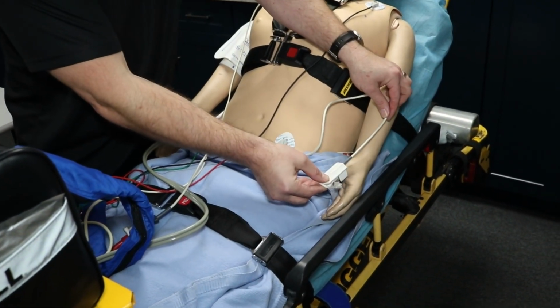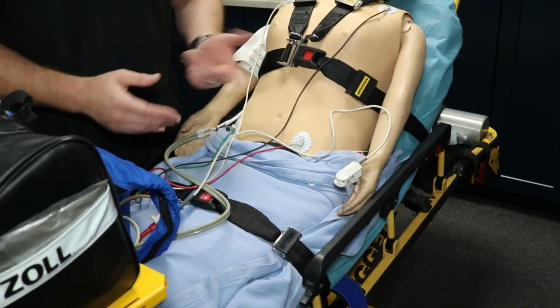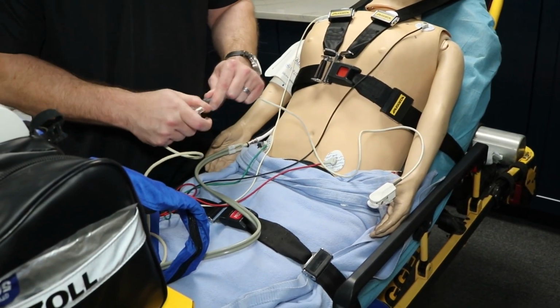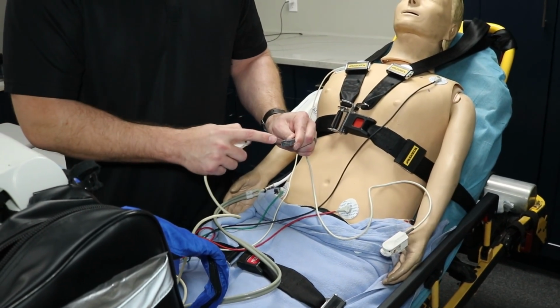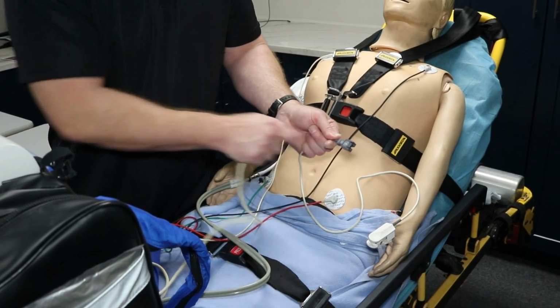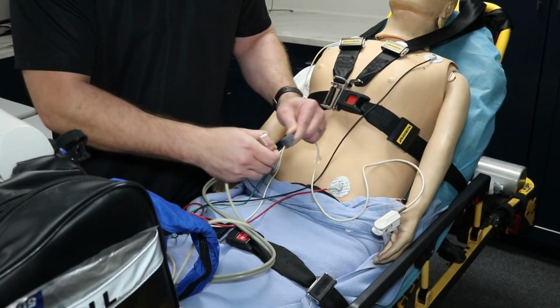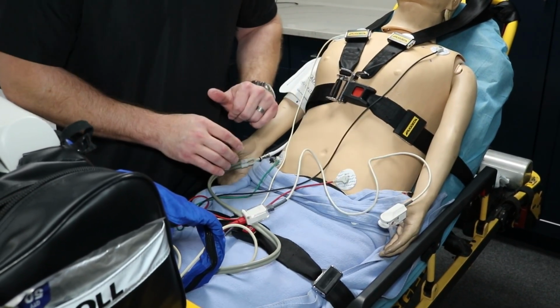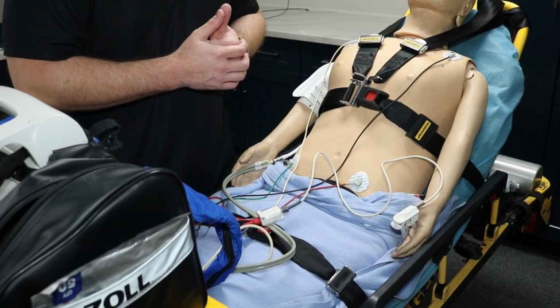So we are going to go ahead and just clamp that on here. This is the non-disposable pulse ox. The patient might already have a disposable pulse ox that's already on, which you should be able to utilize with our pulse ox as well. Make sure that it has a single cutout on the top and then a dual cutout on the bottom, and that will be compatible with our X series. Again, give it a good tug. When it's on, the red light should be lit up on the pulse ox, and that way you know it is actually reading.